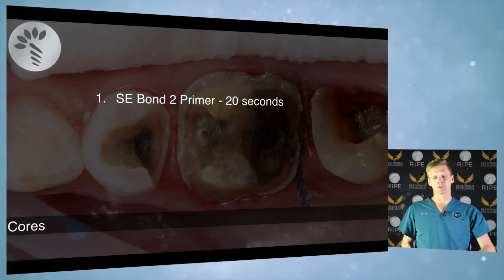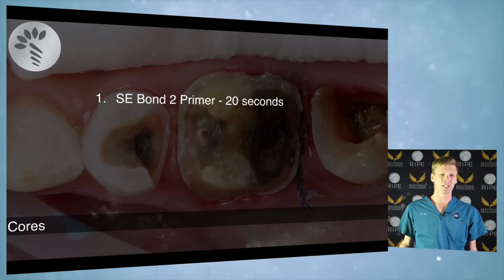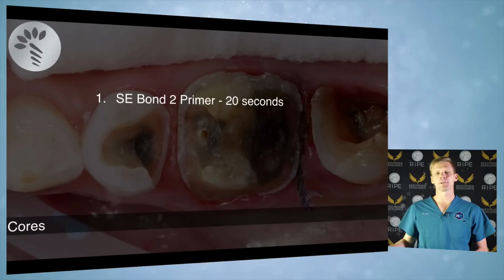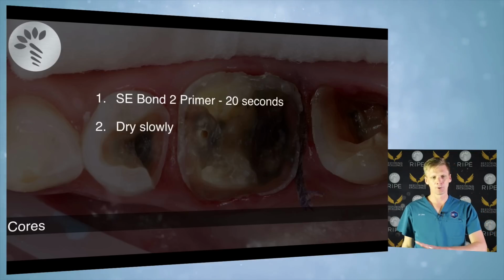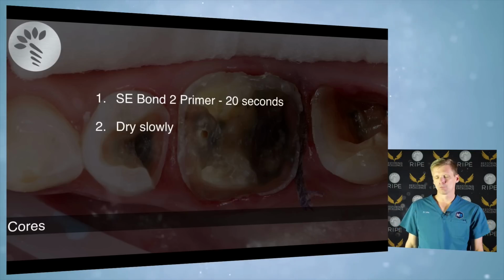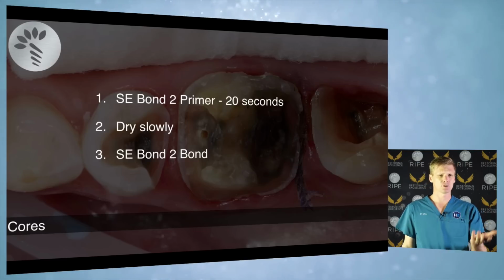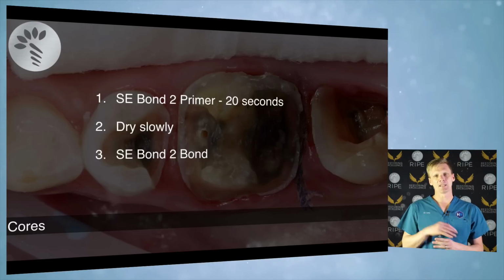So with SE Bond 2, you just put the primer on. You just need to have the tooth dry. You don't get sensitivity, and then you dry it slowly. For all primers, you must dry slowly. This is very important. Then you rub on the SE Bond 2. Now, if you have your own bonding system which you love, then just keep using it. Don't change just because I said to. I'm not telling you to change, I'm just telling you what I use. So with SE Bond 2, I air thin it and cure it.